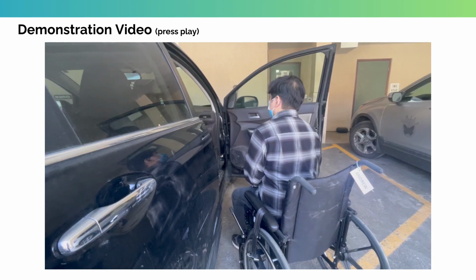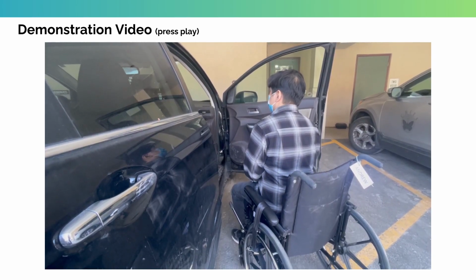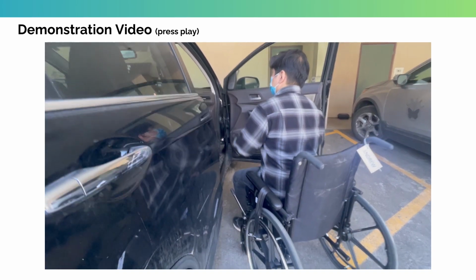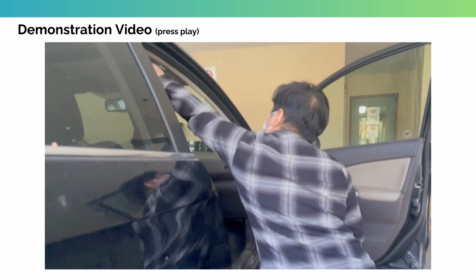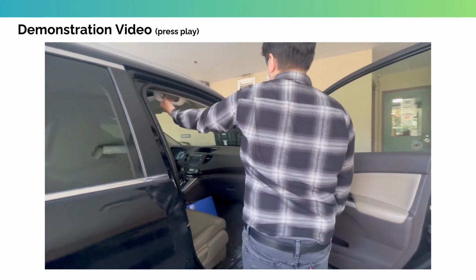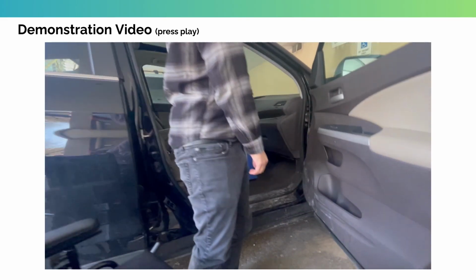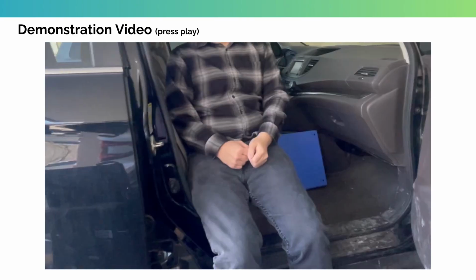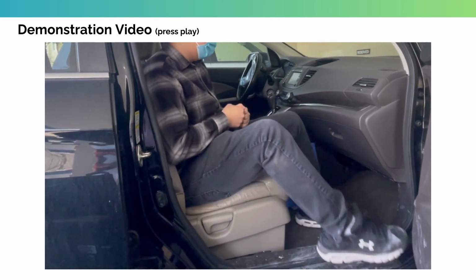The wheelchair should be positioned at an angle close to the vehicle to minimize the distance that the client needs to transfer. Ensure the brakes are on and the seatbelt is undone before cueing the client to stand. Cue the client to reach their stronger arm to the handle above the seat or another stable surface on the vehicle. Then the client pivots using small steps and should be cued to touch the back of their knees to the seat before sitting.